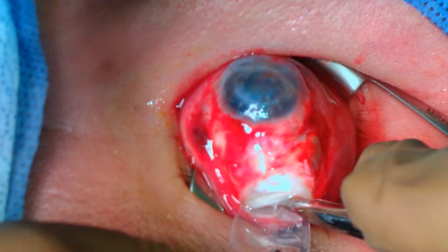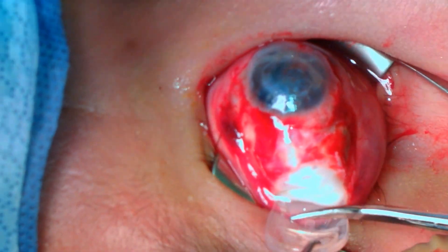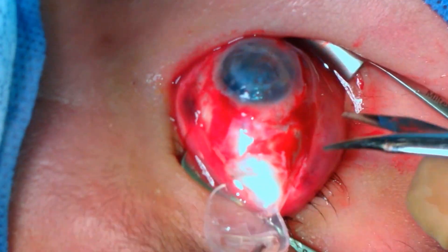At times you can encounter a large reservoir. There are suture holes with adherent scar or sutures that need to be released.